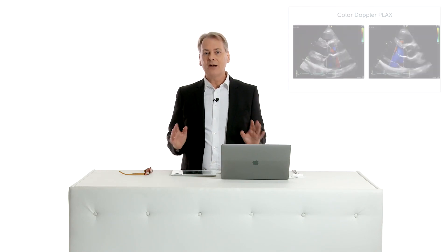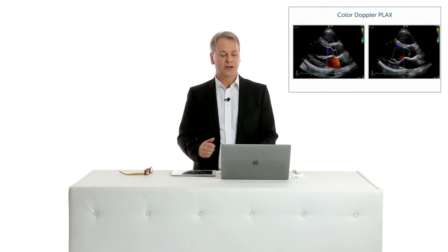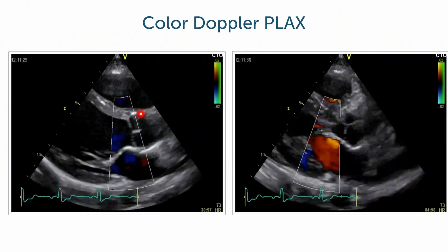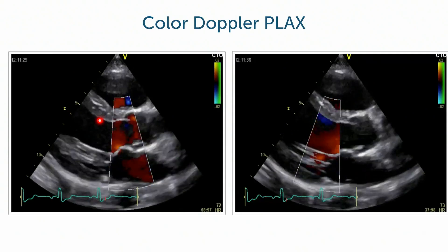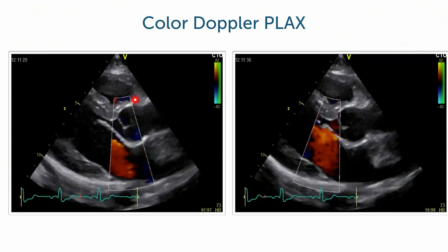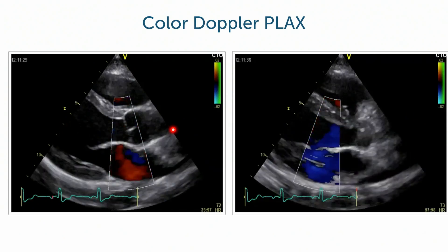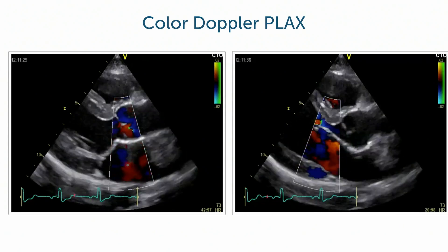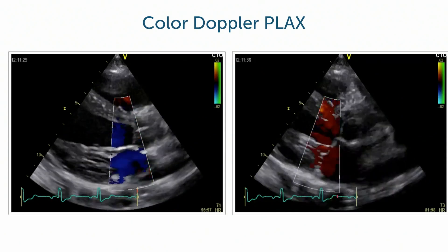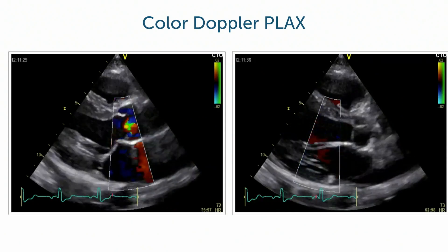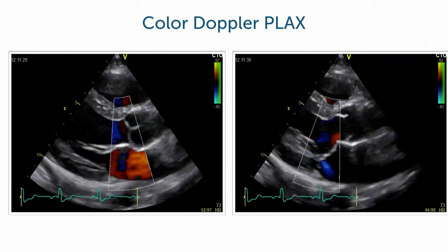We usually start with a parasternal long axis view, and that's also the first place we will use color Doppler. We'll look at flow across the aortic and the mitral valve. You might question why we're using color Doppler here, especially since we have a more or less perpendicular orientation to the flow across both valves. The reason is you still see the jets, and frequently you have eccentric jets, so you will get the best recording from these views.